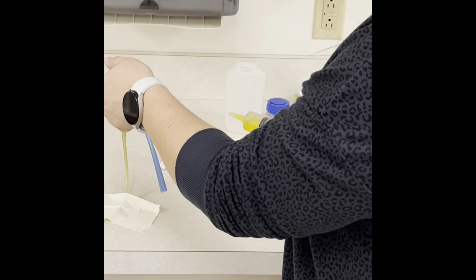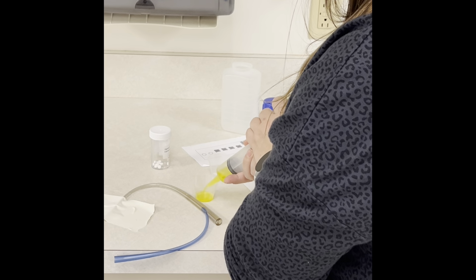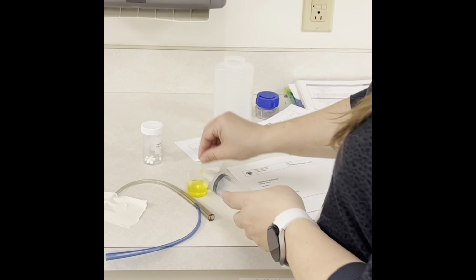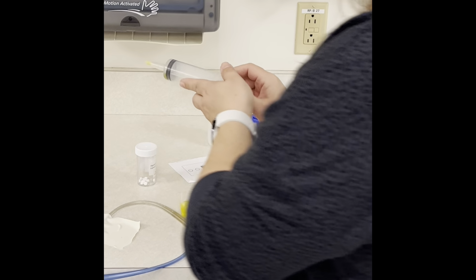I forgot to get a cap for this one. We're gonna put our stomach contents in there. We would verify with the pH strip that we're in the stomach. We're good to go. Then it tells you to draw up the water.